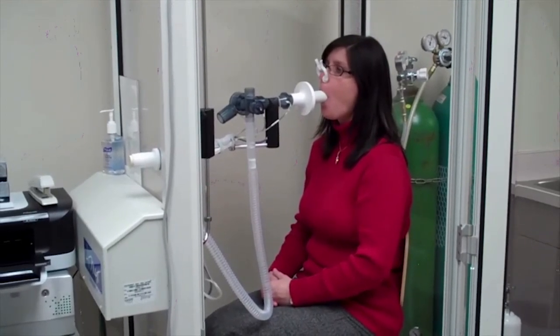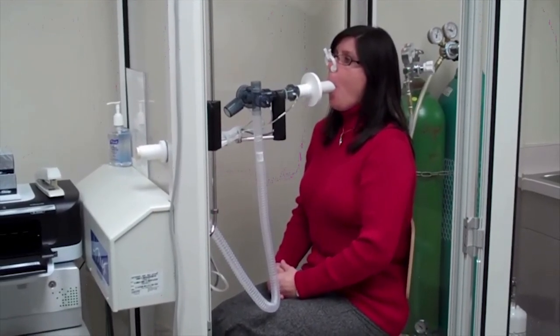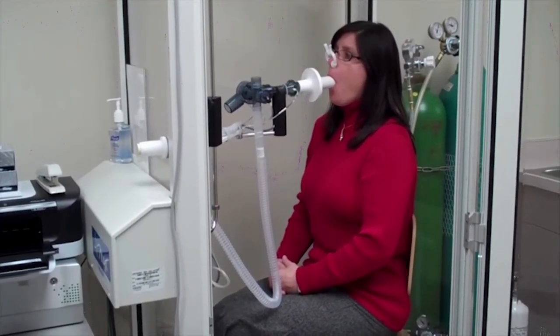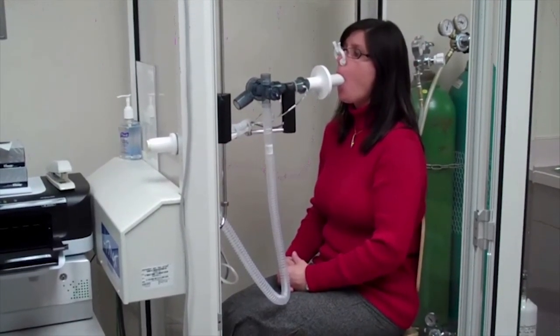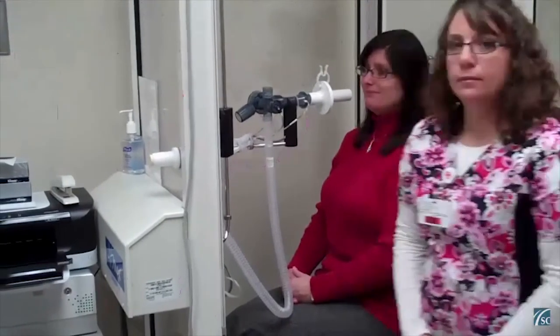Big breath in. Hold breath. Keep holding. You're halfway there already. Keep holding. Blow it all out. Blow, blow, blow. Okay. That completes our pulmonary function test.